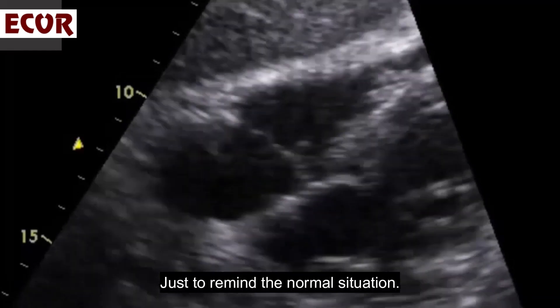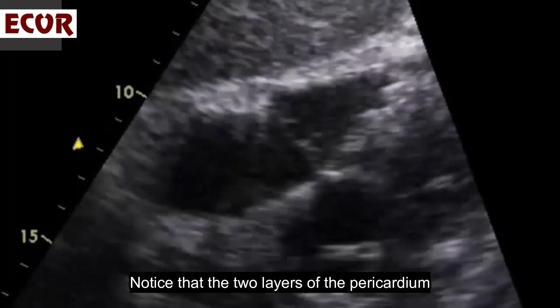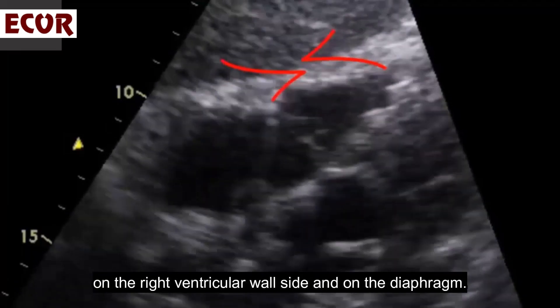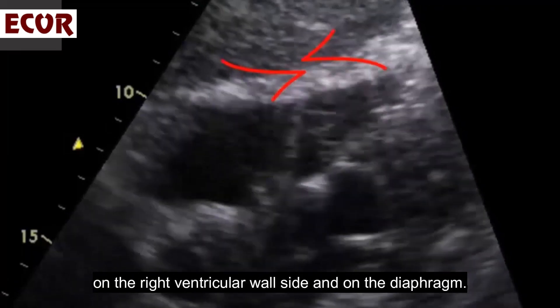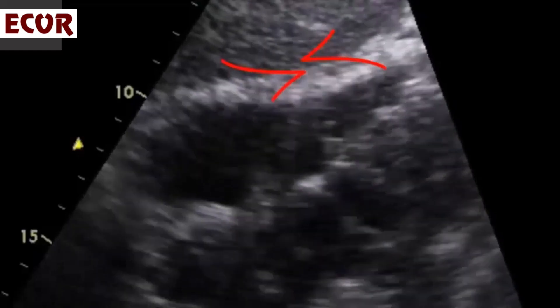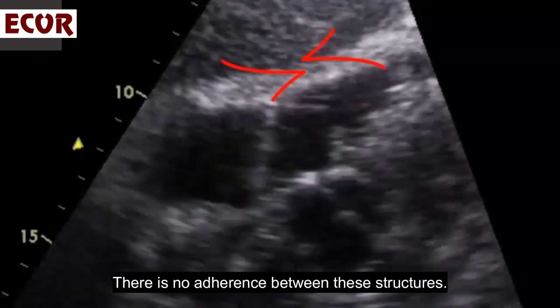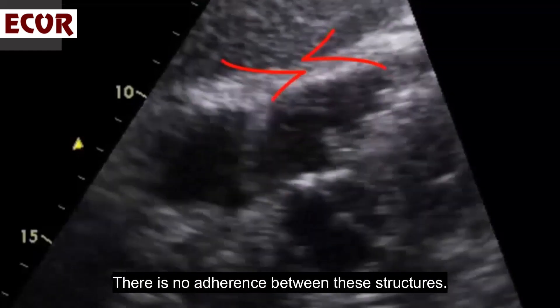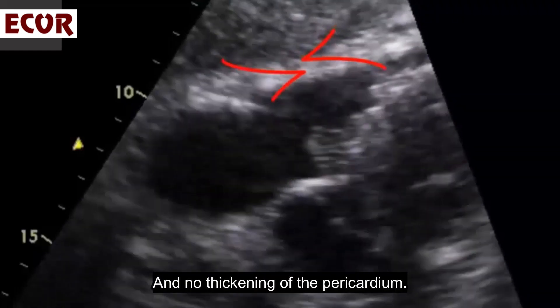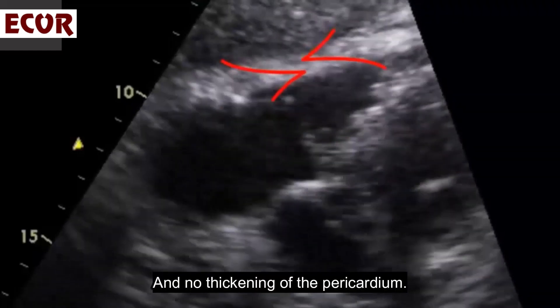Just to remind of the normal situation: notice the two layers of the pericardium on the right ventricular wall side and on the diaphragm. There is no adherence between these structures and no thickening of the pericardium.